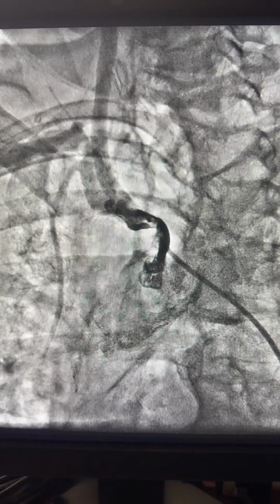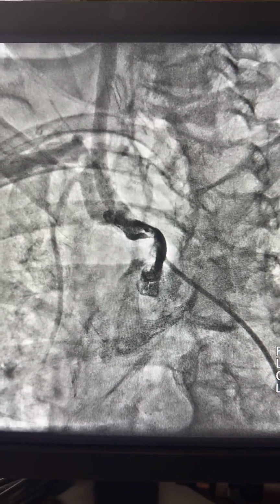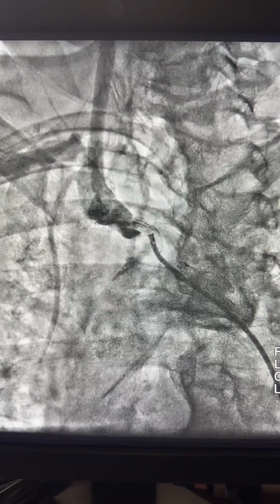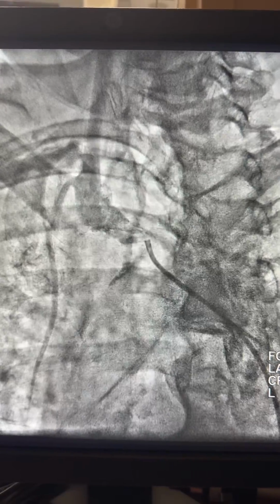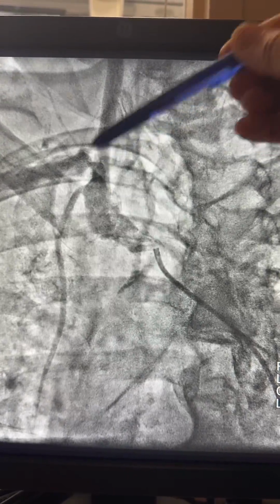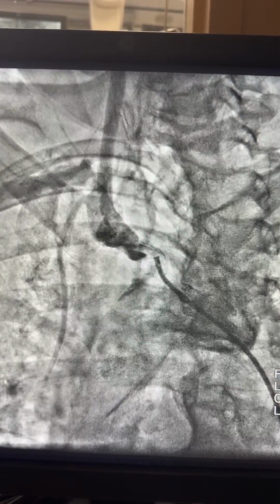Patient had discrepancy in the blood pressure readings and weak pulse in the right radial, and you see here is a severe tight calcified lesion in the trunk, and we have another lesion there in the proximal segment of the subclavian just after the rima.